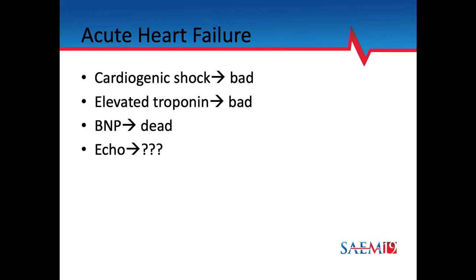Now, historically, emergency physicians have used it as a diagnostic test, right? Impaired systolic function, yes or no, is a way to help us determine if a patient's presentation for dyspnea is related to heart failure. And that's important, but it hasn't really changed much in the last 10 years.